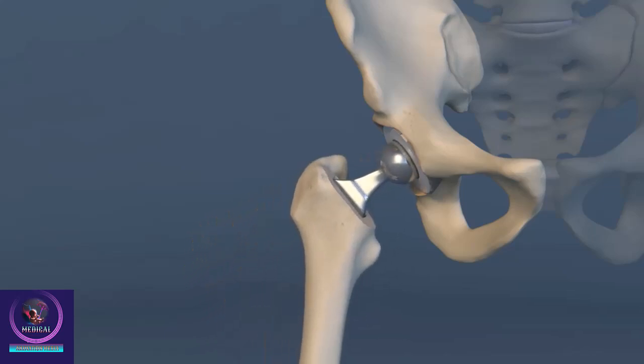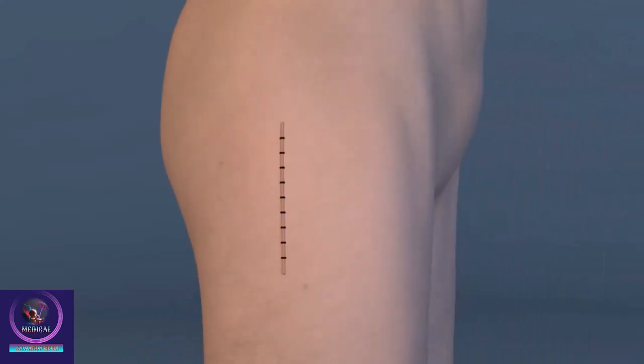The ball is placed into the socket and the joint is tested. Like all surgeries, risks and complications are possible.